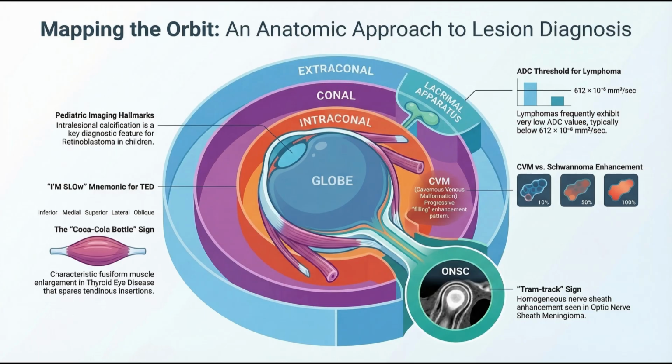Exactly. So just a fraction of an inch of inflammation, whether the tendon is spared or swollen, changes the entire diagnosis. It completely changes the patient's diagnosis and their entire treatment plan. Furthermore, myositis usually only affects one eye, and it causes acute, sharp pain. And TED is typically in both eyes, symmetric, and the swelling itself is usually painless. That tiny geographical distinction on a scan is everything.